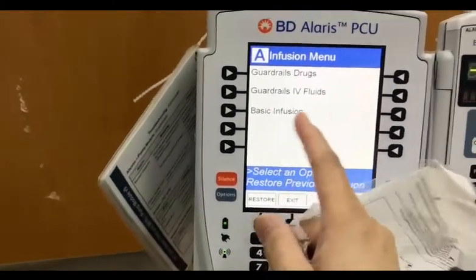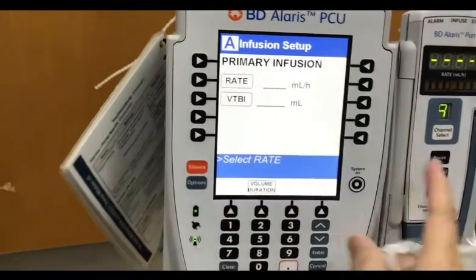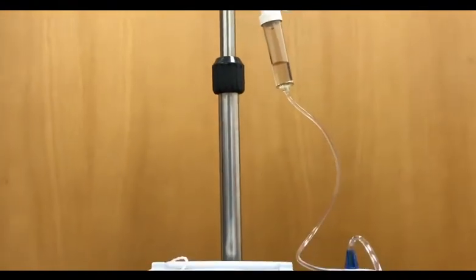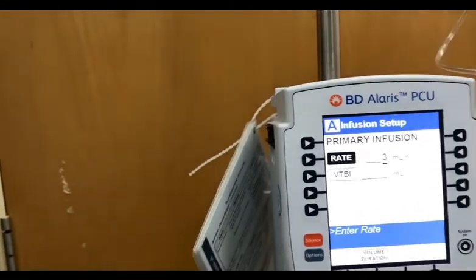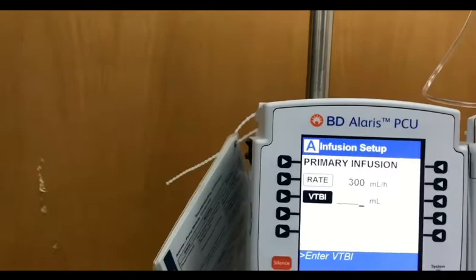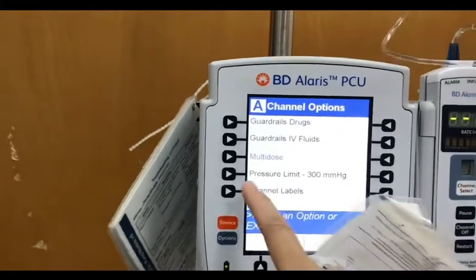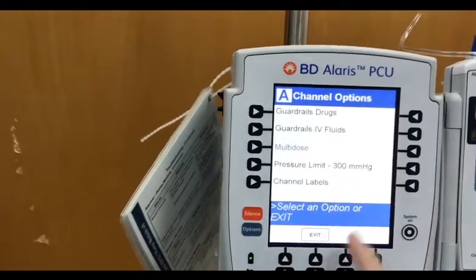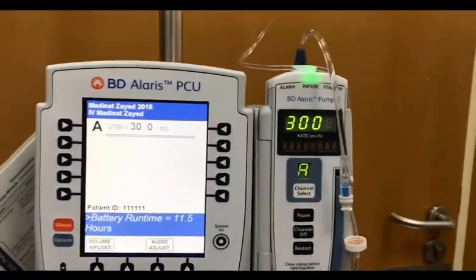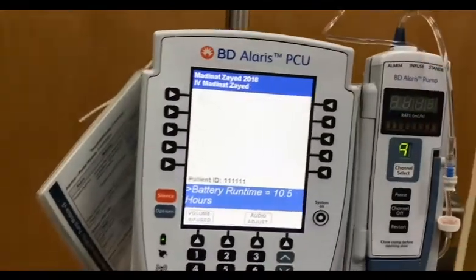And before I set up the guardrails IV fluids, we can also use this basic infusion. Same thing, rate. For example, I am infusing the paracetamol. The rate is 300 ml to be infused for 20 minutes. Amount to be infused, for example, I want to infuse only like 30 ml. So that's it. We have already set this up before. So pressure limit is 300 for the adult. So just press start again. So now it's infusing and wait until it alarms. It has ended. Let us see how it works.